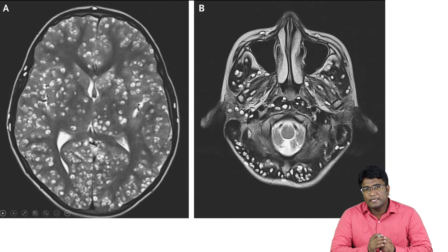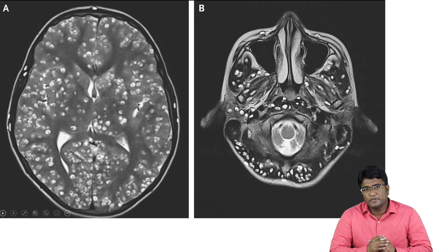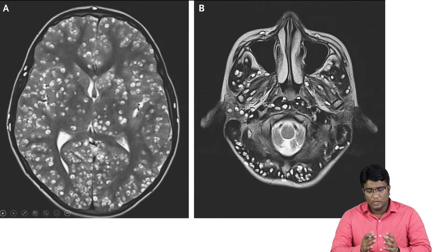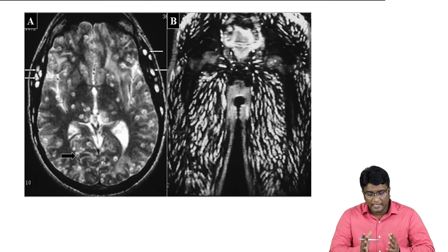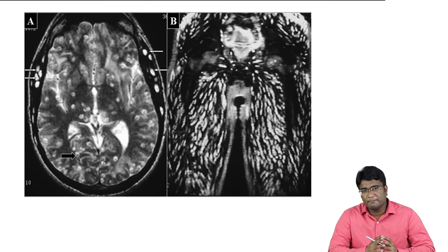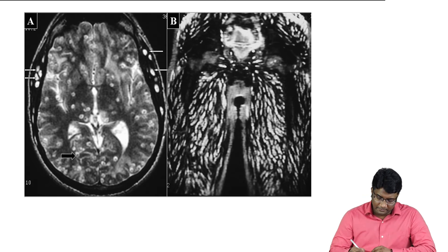Here is another good example of the vesicular stage of neurocysticercosis, showing multiple cysts with a central scolex. Please look at these MRI images — you can see neurocysticercosis involving the brain.